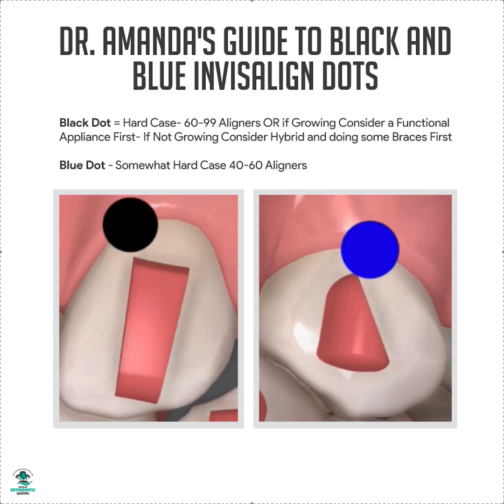If it says intrusion, I'm usually a little bit less concerned. That doesn't always mean it needs a massive attachment. Everything else gets a massive, chunky attachment. Doesn't mean they're going to do it, but I'm going to put one on. I'm going to ask for it.